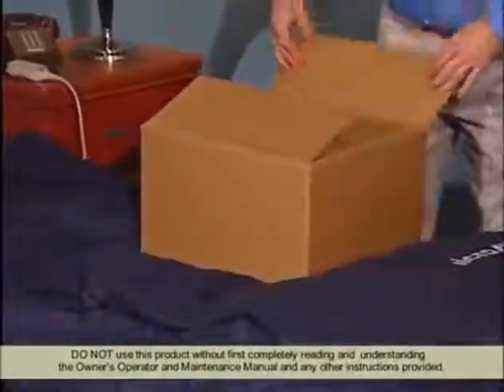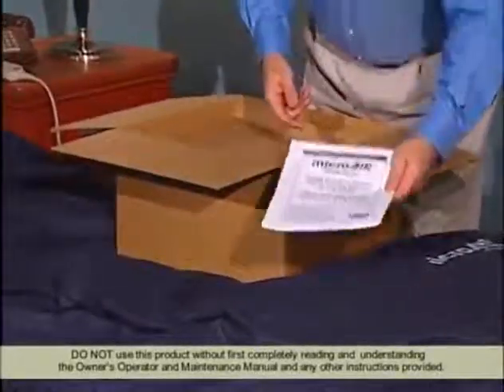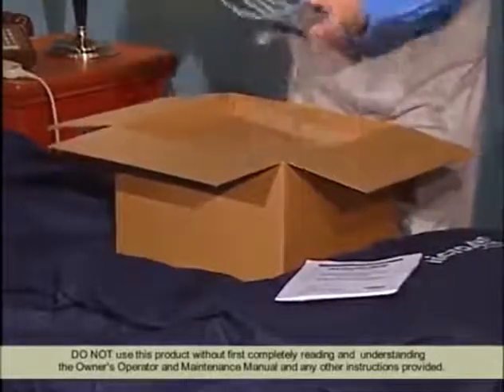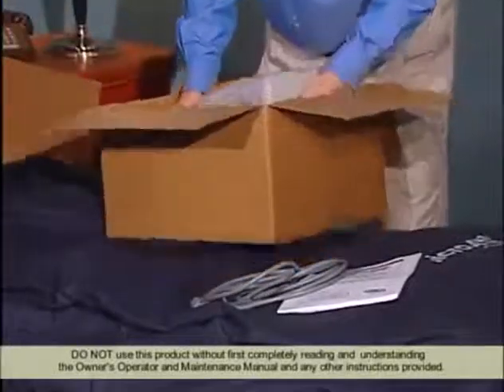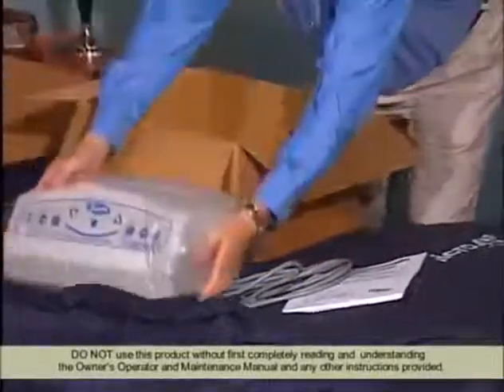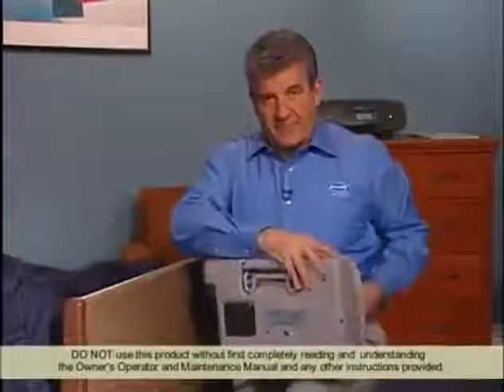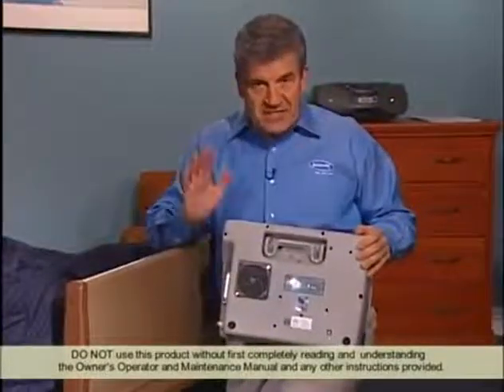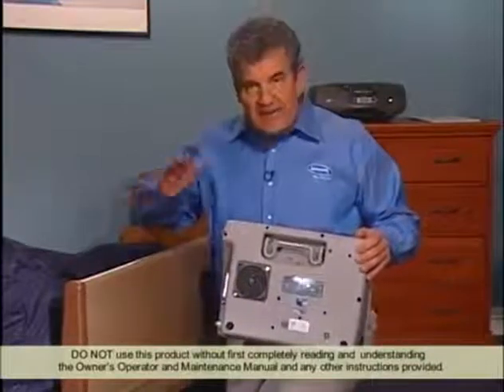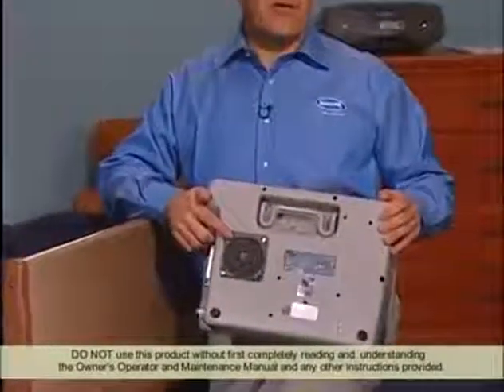Now for the power unit. Open the box, remove the operator's manual, the power cord, and the power unit itself from the box. The blower has a filter on the back. One of the unique differences of blower-based units is they draw in ambient air, so this is going to take the air that's in the room, draw it into the blower, and back out into the mattress itself. This filter is here to clean the air that's being drawn in.